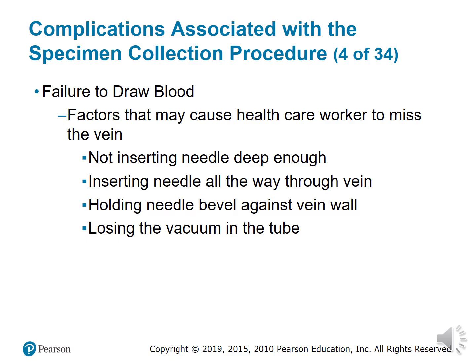But like I said, things happen. It's a machine. So sometimes they don't have the appropriate vacuum that is needed in the tube. Change your tube out. Maybe you had a faulty tube. Just like sometimes we have faulty tourniquets and they pop before we even put it on the patient. Hence why we stretch it out before we put it on the patient, to double check to make sure it's not a faulty tourniquet. It happens.